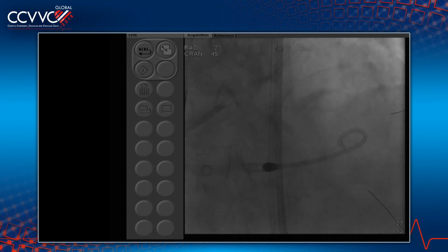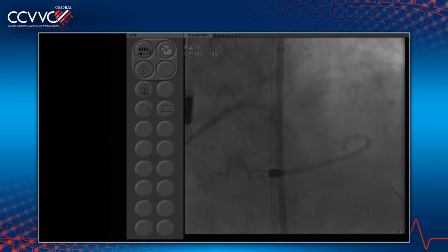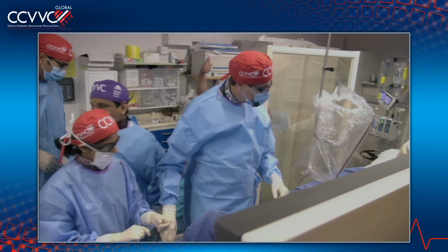What would you do here? Why don't we let you guys work on this? We're going to go to lab 3 if you're okay, Dr. Kini. We'll come back. When we come back to you, lay out to us what kind of luminal diameters and what FFR numbers you got across the LAD and what your plan is, and then show us the final result. Okay. Great. Excellent. Very great case.